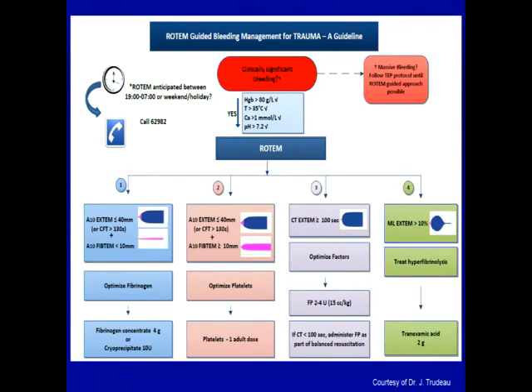So the question was, in a trauma situation where the patient's bleeding actively, are there recommendations or guidelines regarding the frequency of using the ROTEM test? The short answer, as far as I know, is no. There aren't actually a whole lot of guidelines, especially in North America, about the frequency of testing. There are threshold values that are suggested by the American College of Surgeons, specifically in the trauma setting, but they don't make specific recommendations saying you should retest after 30 minutes or 10 minutes. I think at this point there aren't any studies to provide that data. So really, it's more of a clinical judgment call.